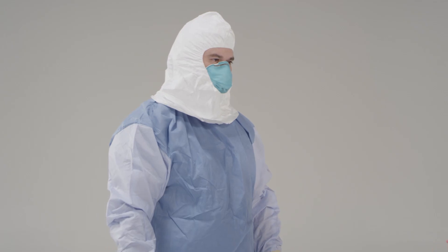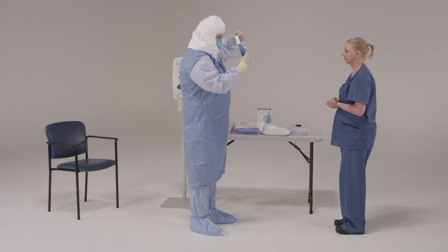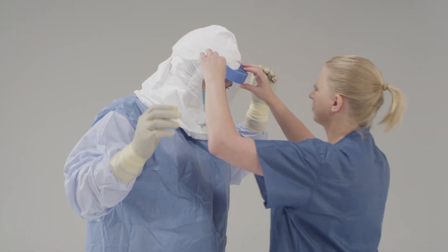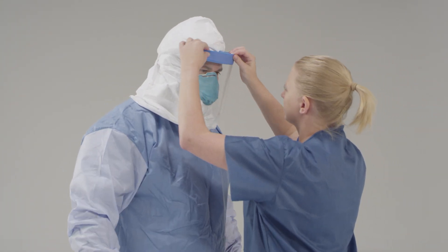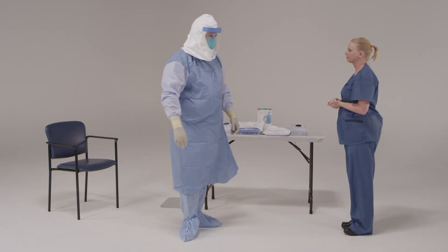Next put on your face shield by placing the elastic strap behind your head, making sure that the foam is resting on your forehead. Put on a full face shield over the N95 respirator and surgical hood to provide additional protection to the front and sides of the face, including skin and eyes. Bending forward, hold onto the face shield with both hands. Expand the elastic with your thumbs and place the elastic behind your head so that the foam rests on your forehead. Once the shield is situated, check to make sure it covers the front and sides of the face and no areas are left uncovered.